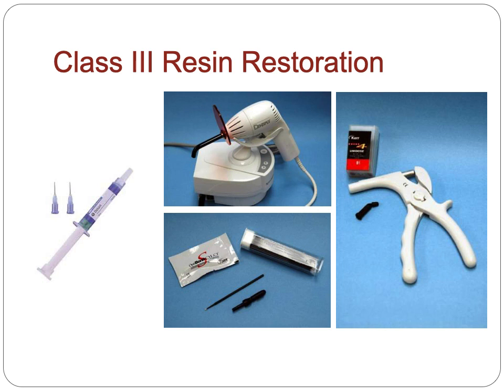After that, we need to place our bonding material, and we spoke about the type of bonding material. If you remember, we have total etch, we have self etch. It depends on the material that we have in the lab. We will place our bonding agent, and then cure it depending on the manufacturer instruction. After that, we will place our composite restoration, build it in increments to decrease the effect of polymerization shrinkage, and finally have the normal shape of the tooth structure. We will check the anatomy, the function, and the color of the restoration.